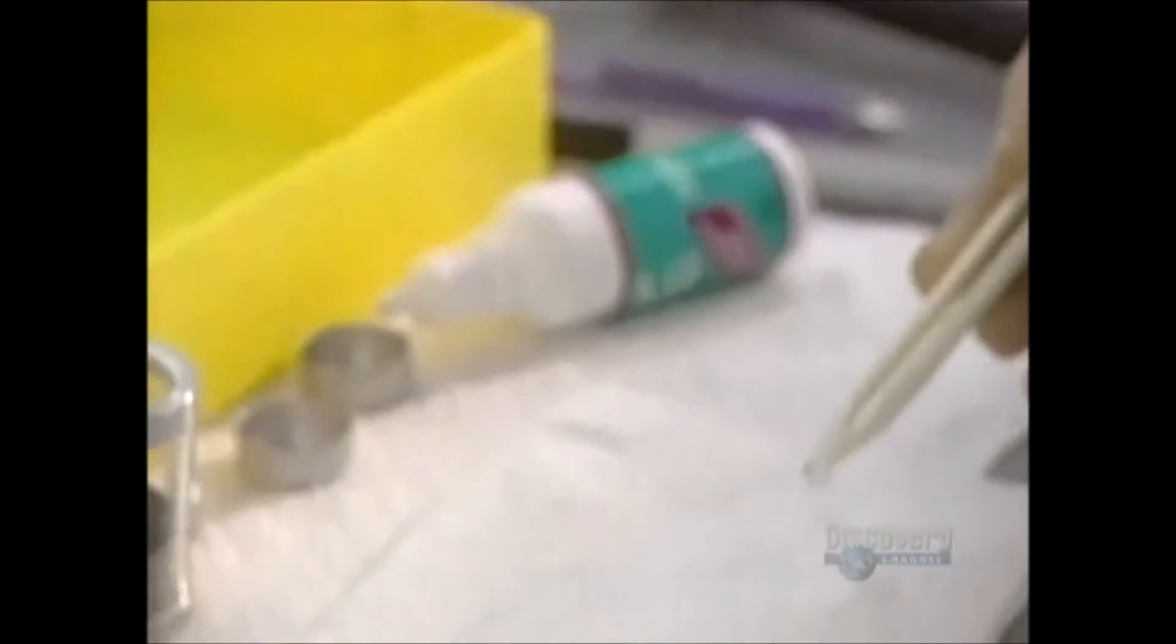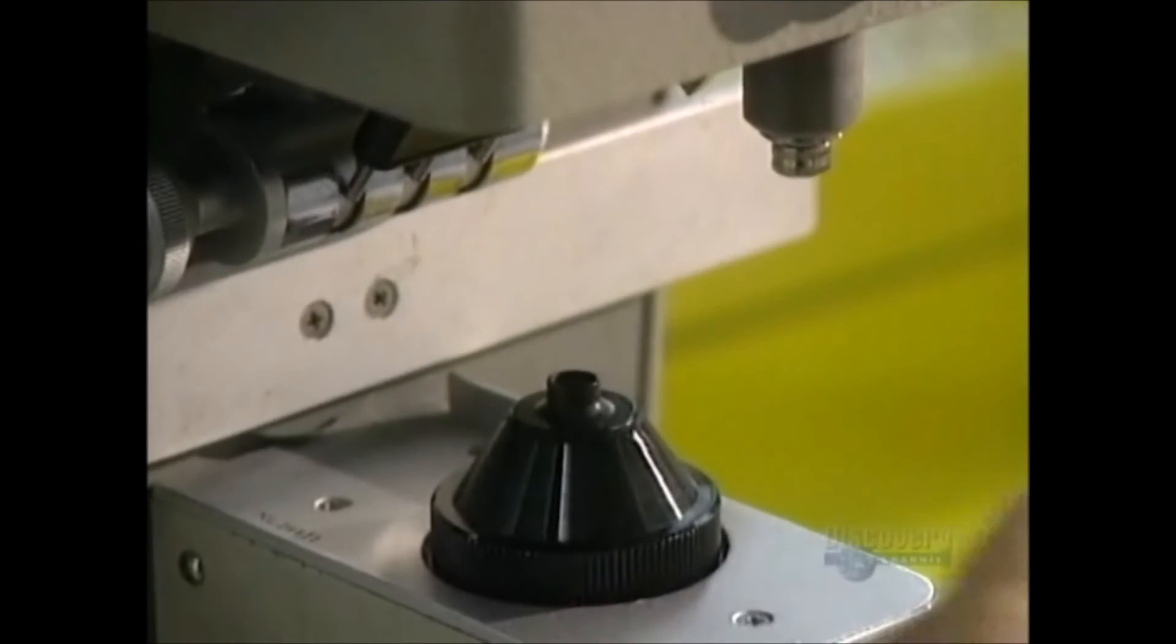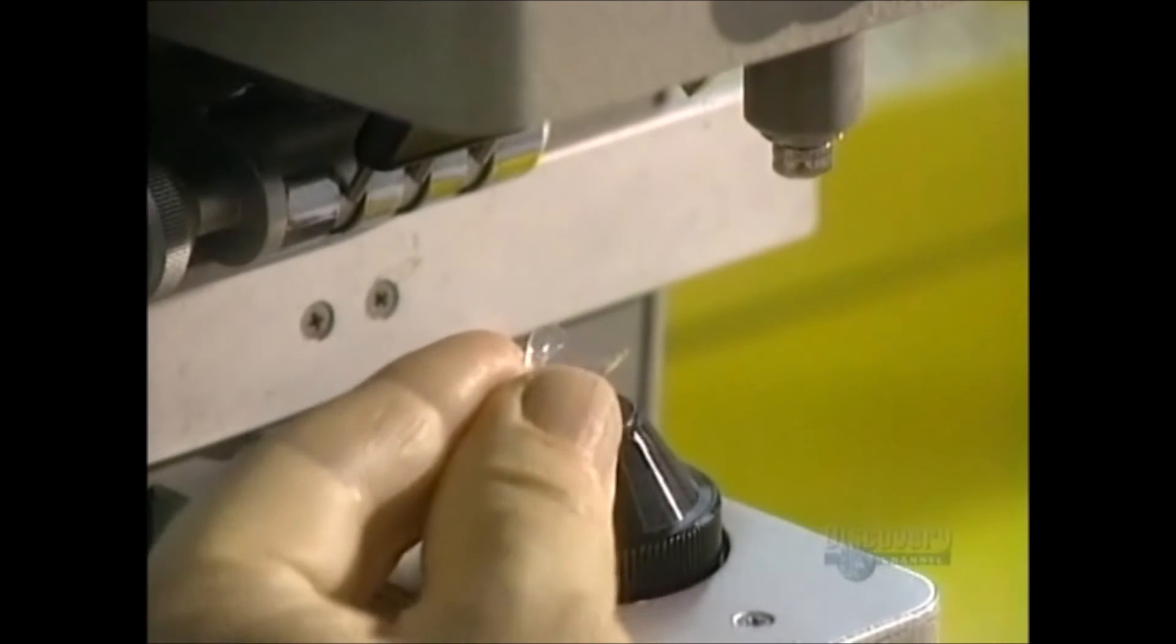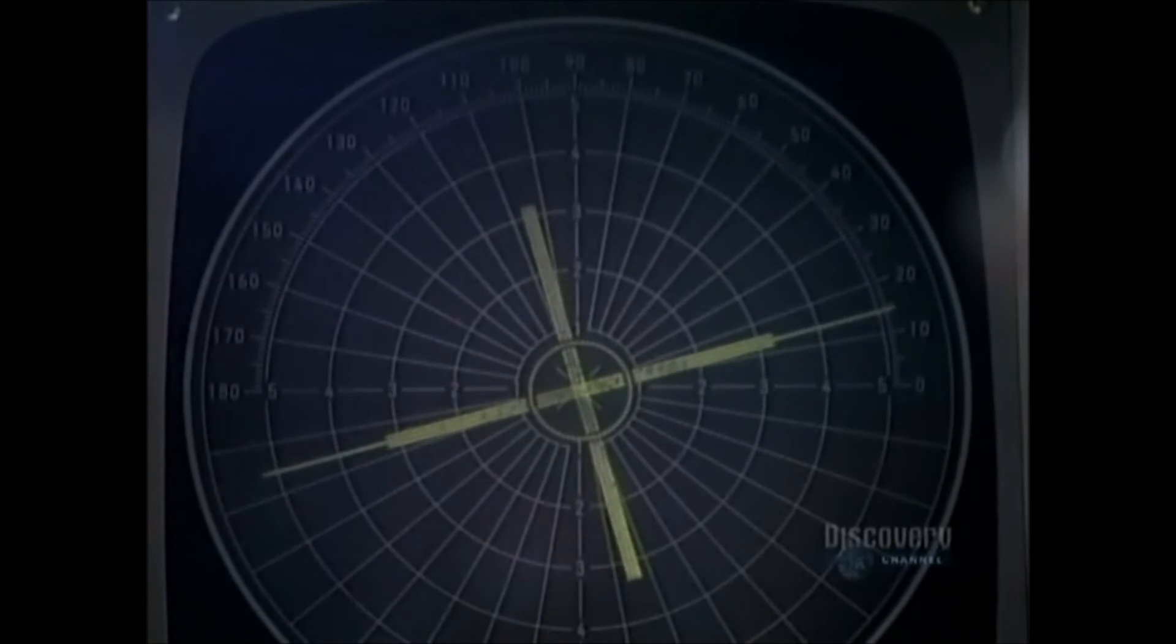And now we proceed with another important testing procedure. The soft, fragile lenses are always handled with the greatest of care. This unit, called a frontofocal meter, is a metering device which verifies the optical precision of the lens.